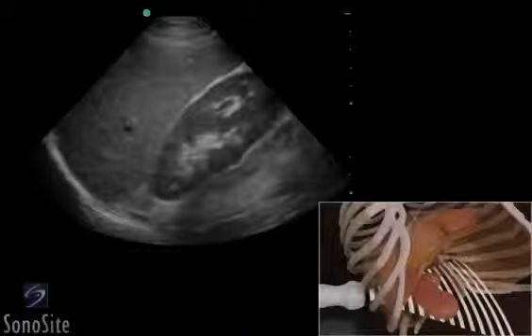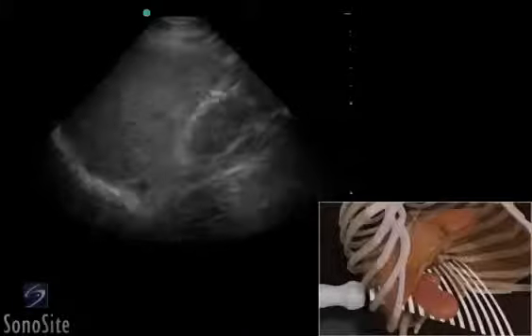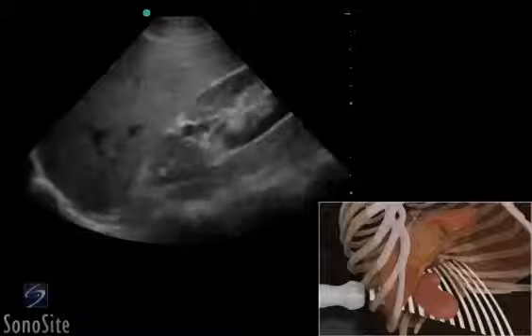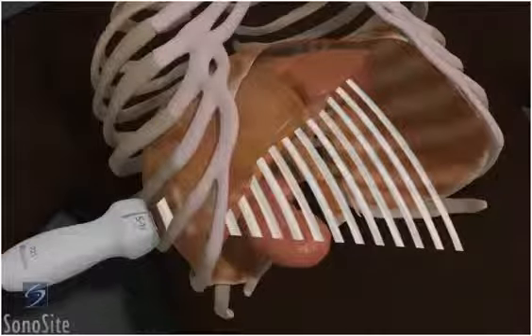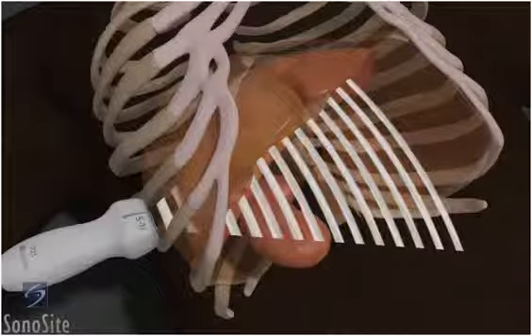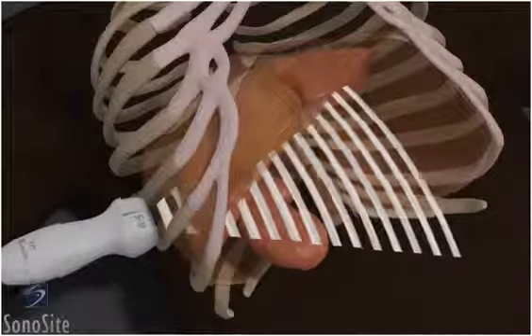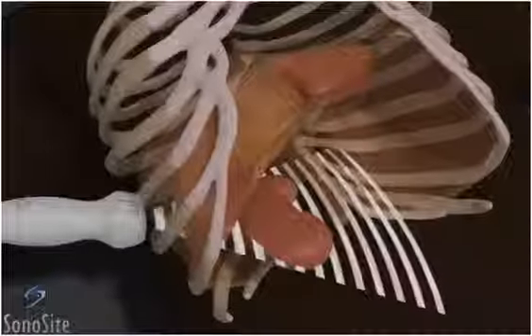A phased array transducer with an abdomen exam type is used to perform the right upper quadrant view of the FAST exam. The orientation marker is directed toward the patient's head. The transducer is placed in a long axis orientation along the right mid-axillary line between the 7th to 9th intercostal space. Rotation and oblique positioning of the transducer will help eliminate rib shadows.